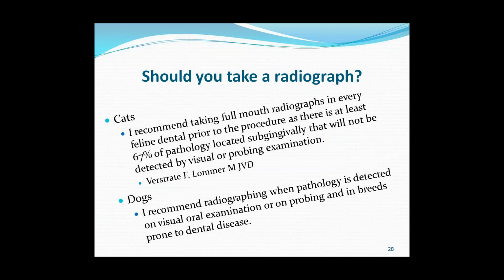So in summary, I believe that we should be taking more radiographs than we currently do, because we should be able to use them to diagnose disease. We should be able to use them to aid in our treatment plans and also make our life easier for situations such as extractions. We can also use them for advanced dentistry, such as root canals.